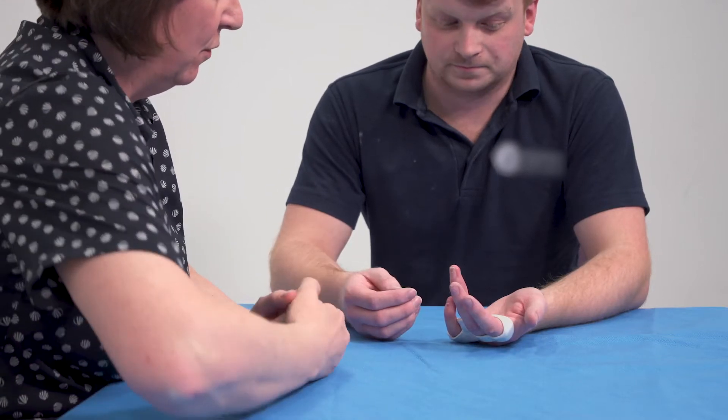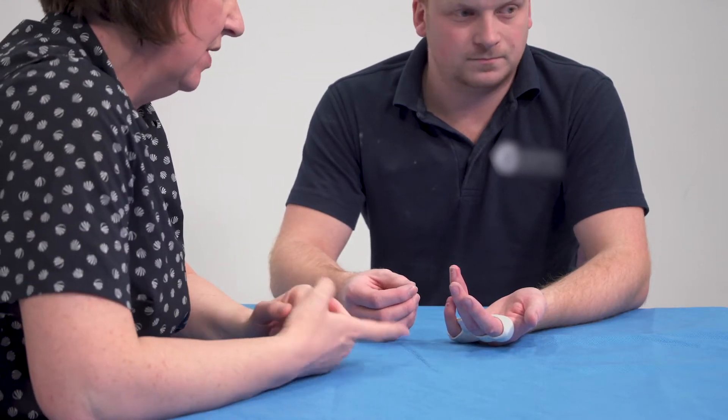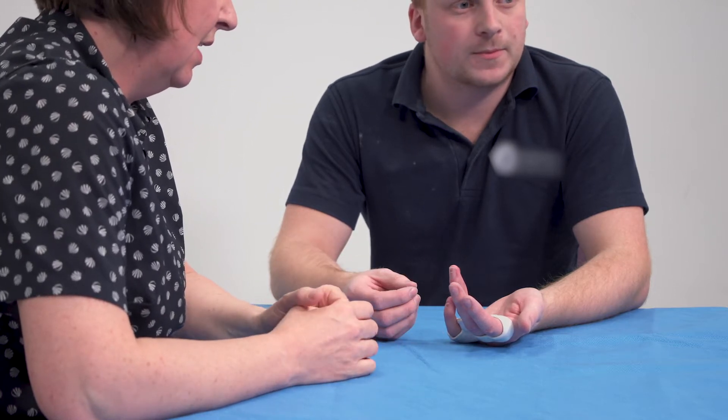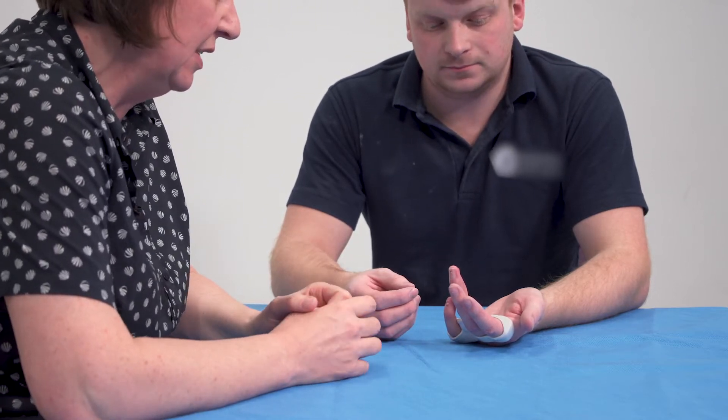Here we have a patient who's about four and a half weeks from the time that they injured their finger, and what I'm going to demonstrate is how we determine the angle that we need to put the splint on.